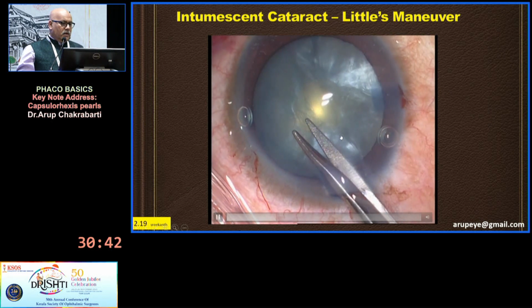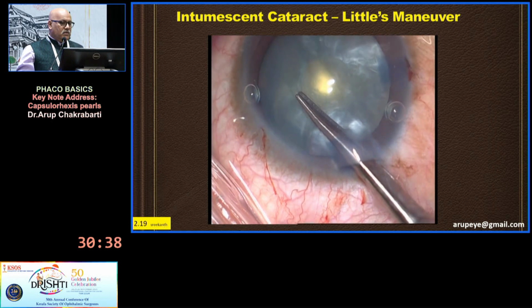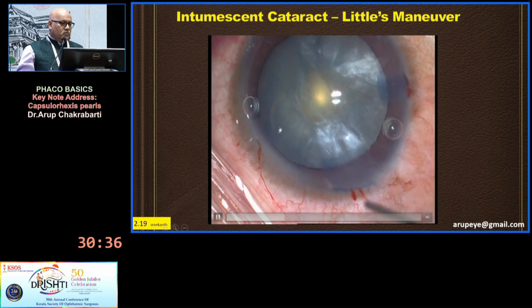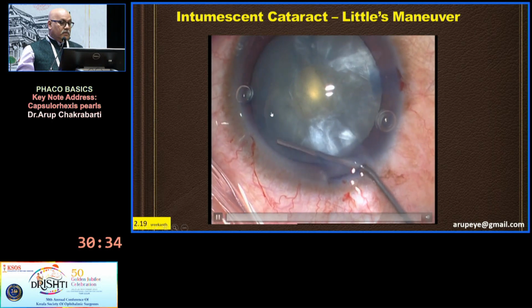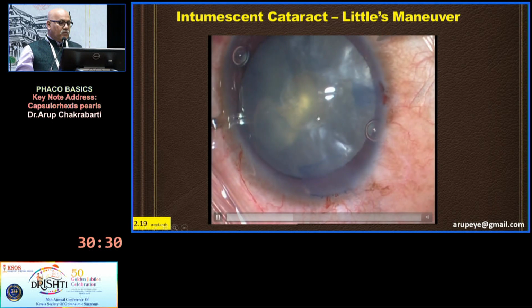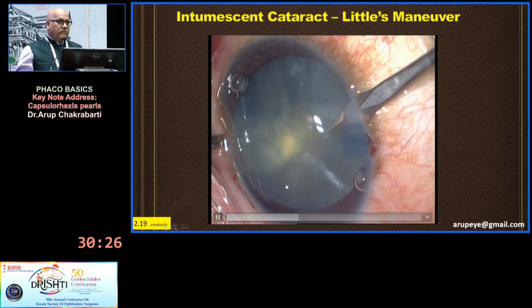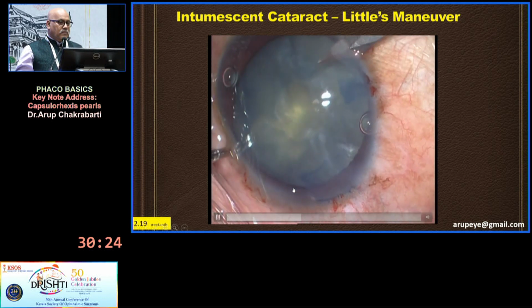Now, when I cut this anterior capsule here, again I'm using the Vannas scissors. So here it cut it and then it pulled it back. So you have a rhexis, a capsular flap which goes almost to the periphery. So it is important to inject the cohesive OVD not at the center but at the periphery, to where the potential rhexis tear might happen.